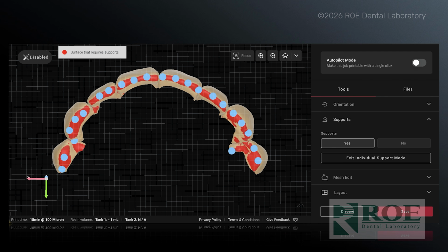So when we start looking at this, we are very much under-supported. And what I mean by under-supported is every incisal edge needs to be supported by a minimum of 3 points. So you need the distal incisal edges as well as somewhere in the central. I like to try to get as many as I can, but on smaller teeth, you just need to ensure the incisal edges are intact with supports.